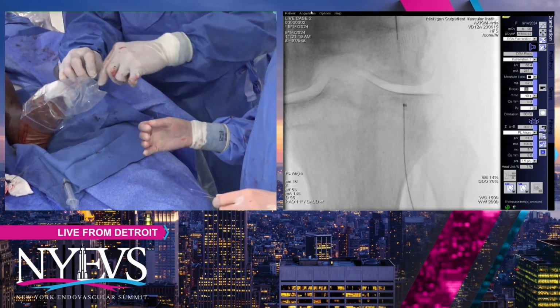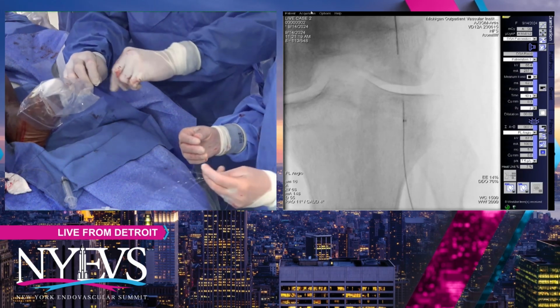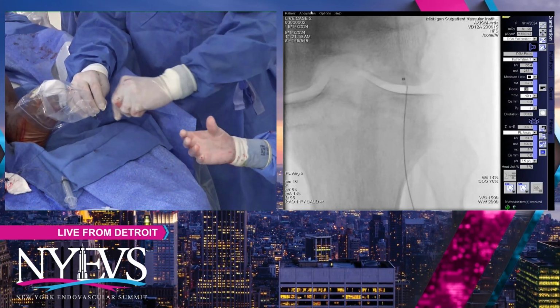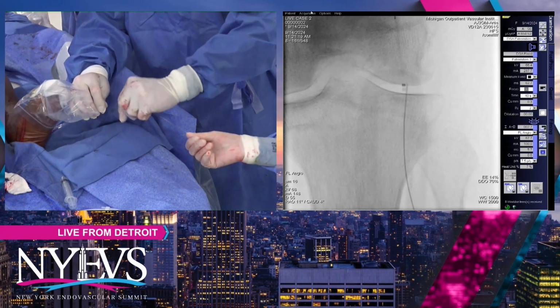Are you guys normally sheathless? Sheathless, yeah. Just do a support catheter. Sure. Would anybody go pedal only in this situation?